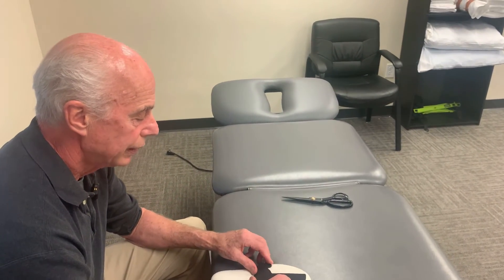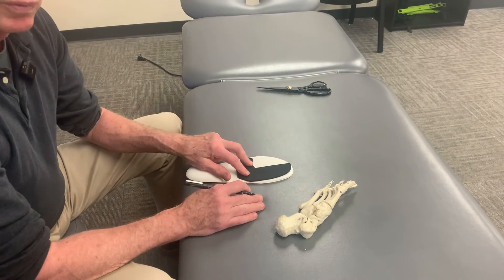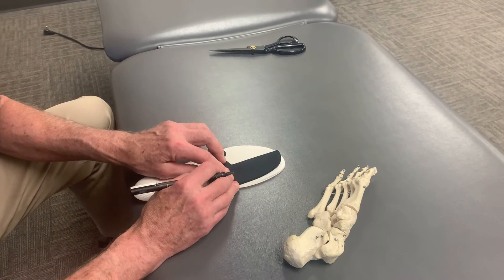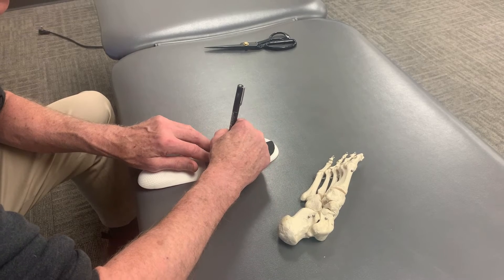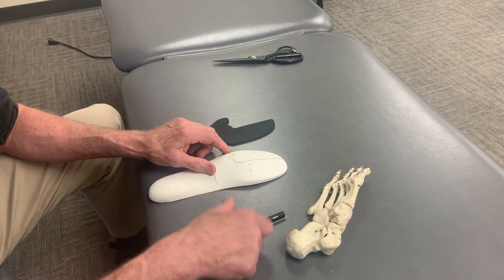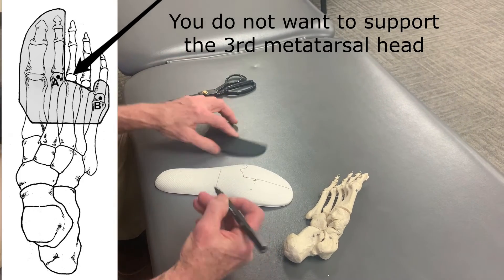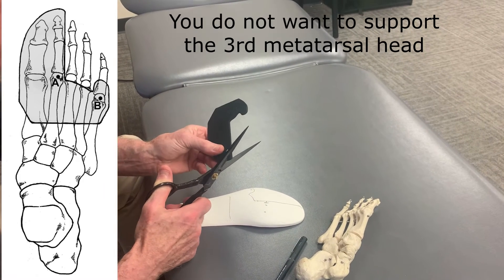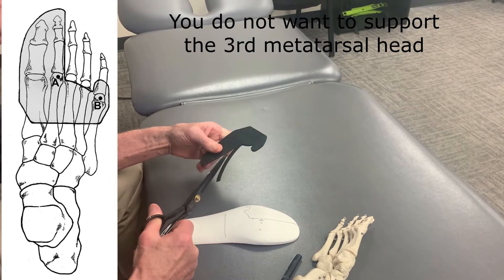Then you set this up so that you support all of those structures. With this one, we don't have to modify it too much — sometimes you have to cut them down a little bit. You can see I've got the fifth metatarsal head right under that spot, so I make a little outline so I know where it's going to go. I'm a little bit over from the second metatarsal head, so I'll take off just enough — I take a scissors, hold it straight, and cut just enough so that it butts up next to the second metatarsal head.